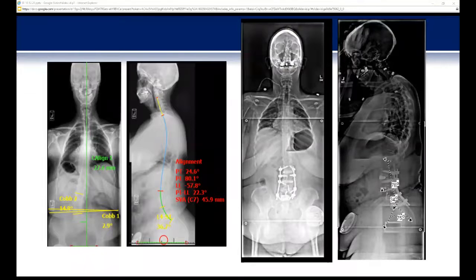I think choosing your landing spot is important. In this case, we tried to end where the pedicle screws are relatively parallel, which is a nice transition to the thoracolumbar junction. You're staying below L1 if you can. This is a nice place to do something less invasive and just rebalance the patient, versus doing something that involves a lot of correction. If you're doing a substantial amount of correction, then you have to be pretty cautious with your UIV. In this case, we didn't use iliac fixation. She had monster bone in her S1 and L5, so we didn't feel the need to go all the way down to the pelvis. Certainly, adding pelvic fixation also makes the construct more rigid and likely puts more pressure at the proximal level. Those are all things you have to weigh in your decision making.